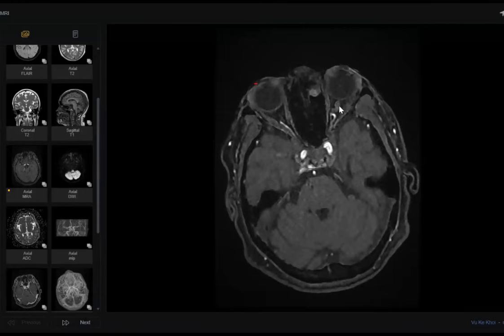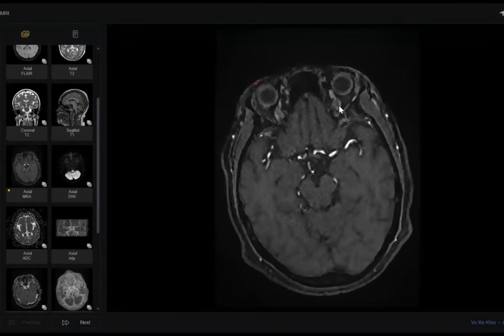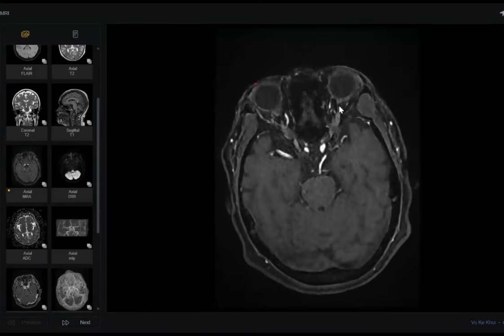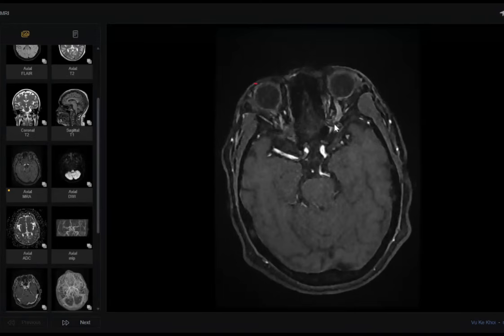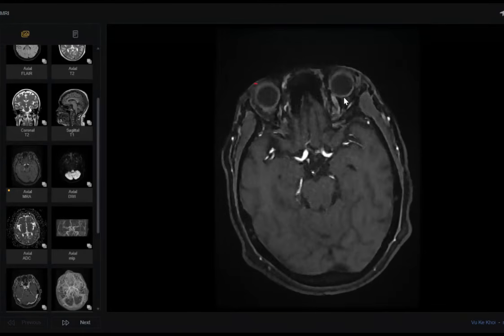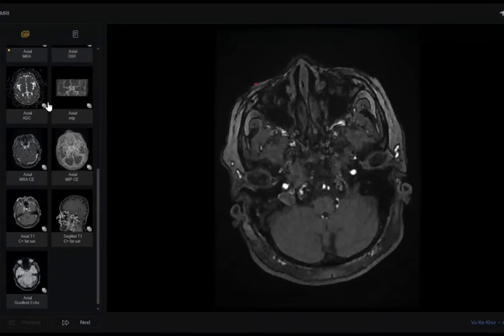Okay, sir, my colleagues, what happened? The artery is pathologically connected with the cavernous veins. So the intracavernous pressure is raised. So it causes a reflux here, reflux in the superior ophthalmic vein. Thank you, doctor, so much. Thank you, sir. Take care, my colleague.